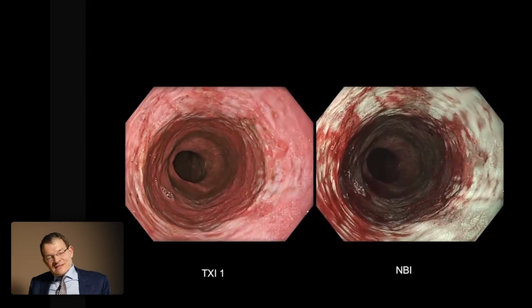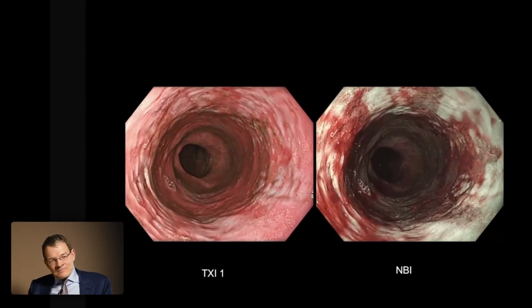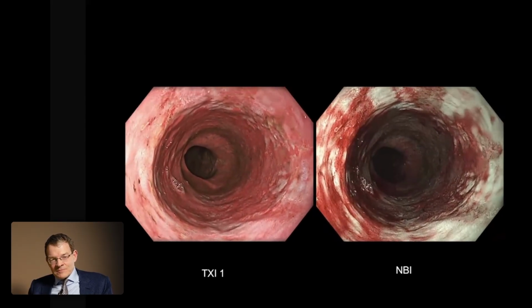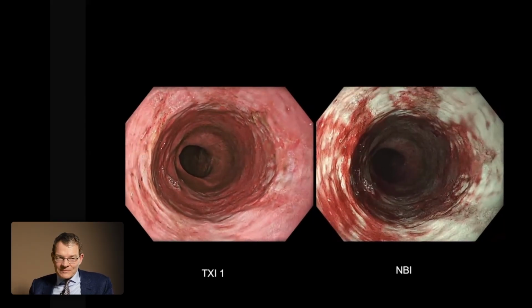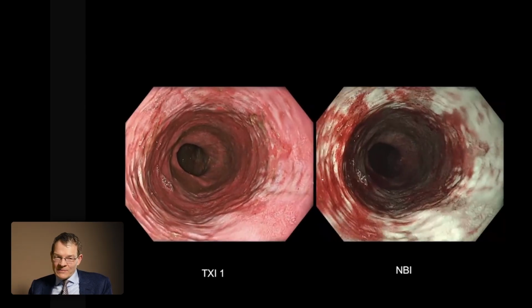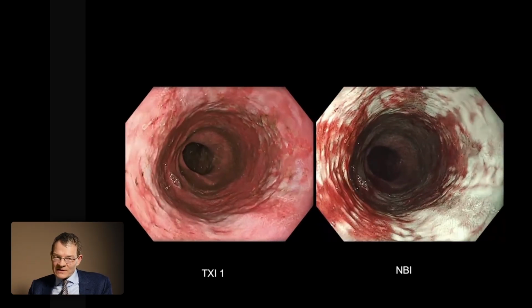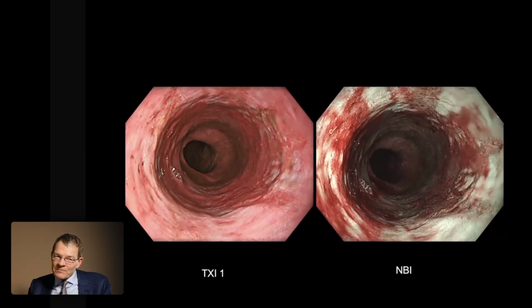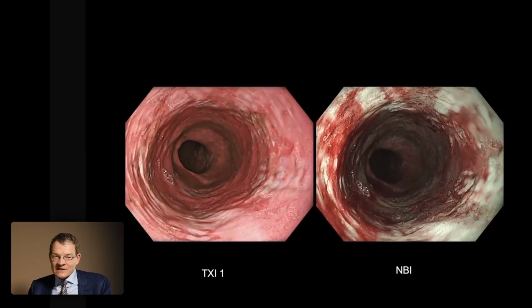So yes, this is another example of how we should use the new features. NBI was always recommended for better detection of Barrett's early cancer lesions. But if you have a patient with a severe reflux esophagitis, the image gets worse.